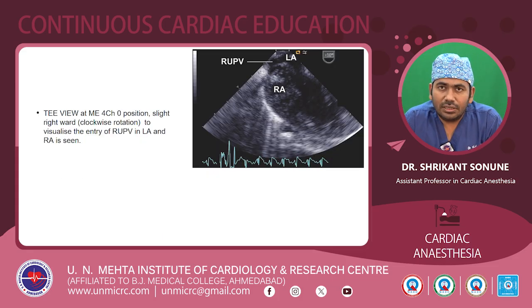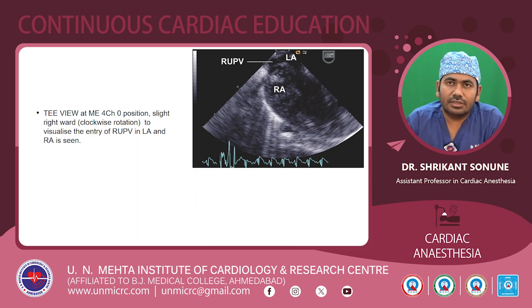So, this is another echo image. Basically, this is the transesophageal echo view taken at the mid-esophageal 4-chamber view at an angle of 0 degrees. In this view, we have focused on the RA and the right upper pulmonic vein origin, and after doing a rightward rotation or clockwise rotation, the right upper pulmonic vein can be visualized and its course can be traced as it is opening in the left atrium.